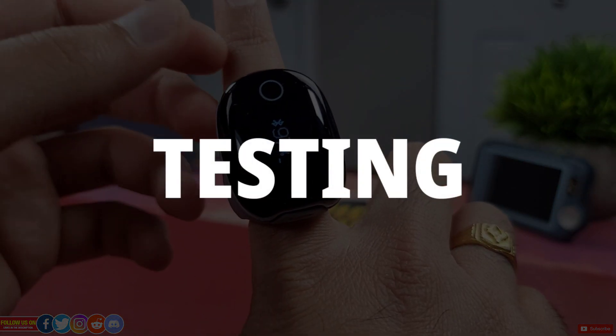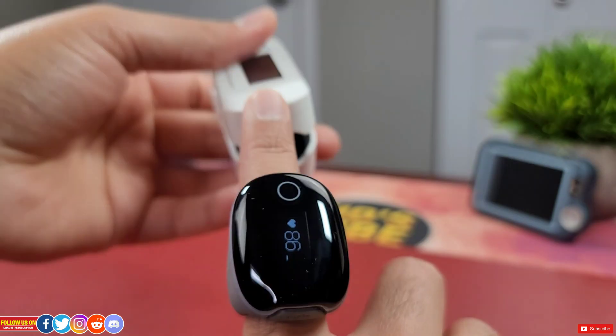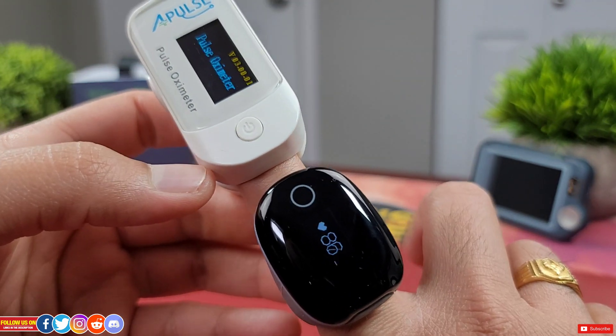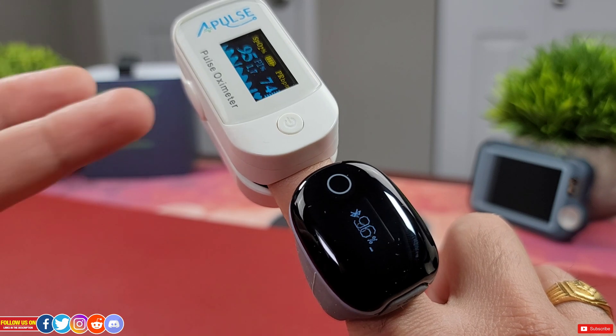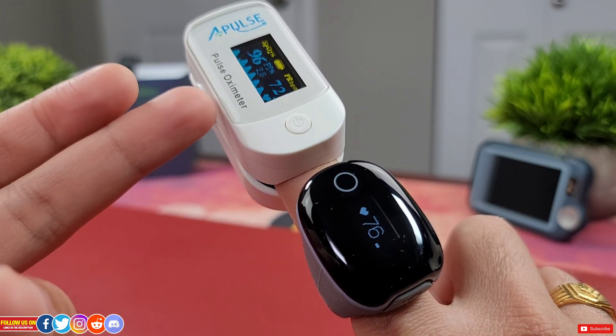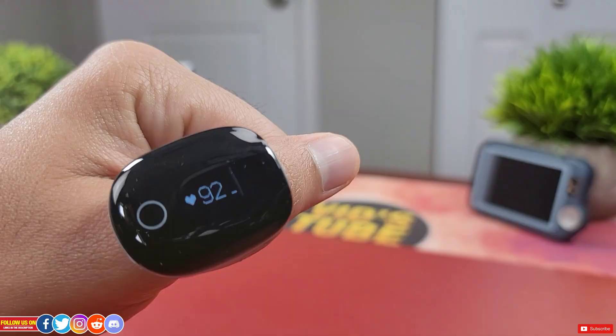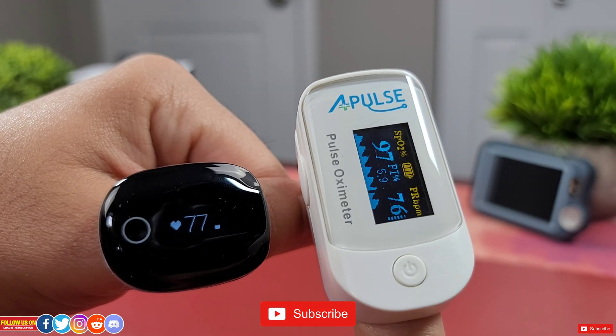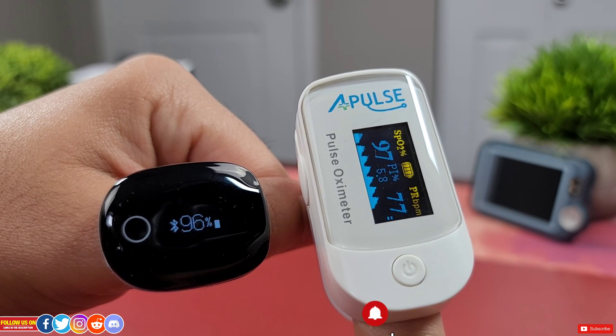Now let's test its readings against a finger oximeter. Starting with the index finger on my right hand, you can see it's pretty close for both SpO2 and heart rate readings. Checking on the left side index finger, again the readings are pretty close.